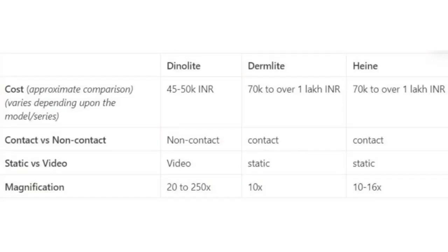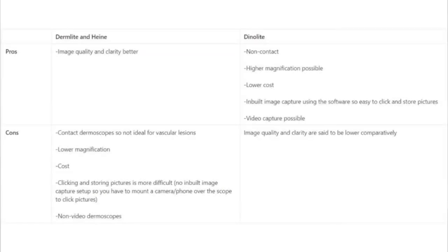Here is a comparison of the three commonly used dermoscopes in terms of cost, contact versus non-contact, static versus video — a video dermoscope allows you to make a video recording of the dermoscopy — and finally magnification. Talking about pros and cons: first, Derm Light and Heinz have quite similar pros and cons. The advantage is that the image quality and clarity of pictures taken using these dermoscopes is very very good — better than Dino Light.